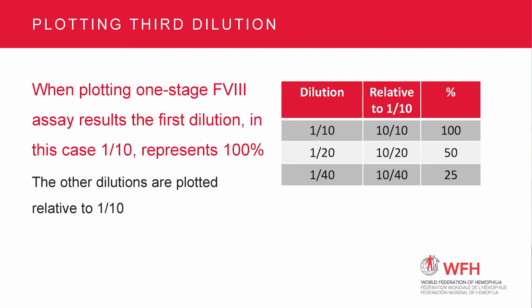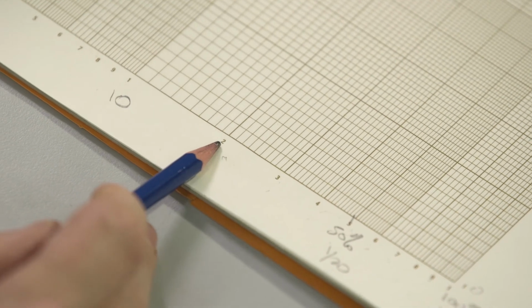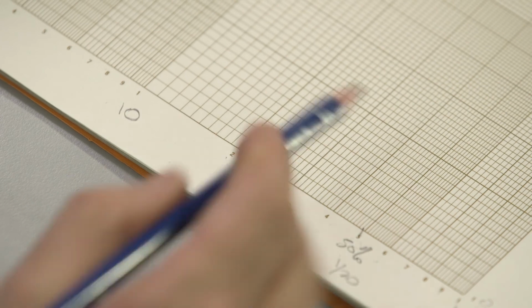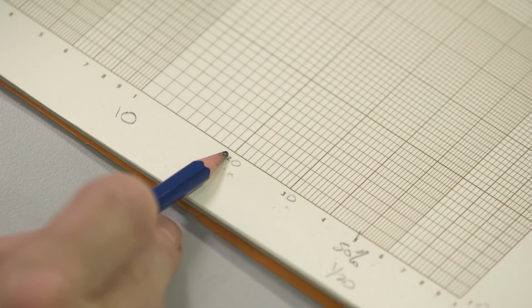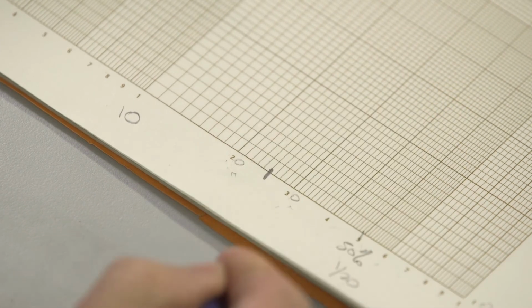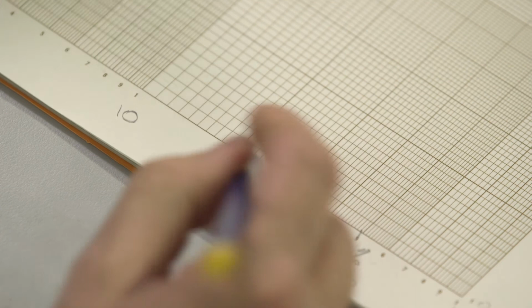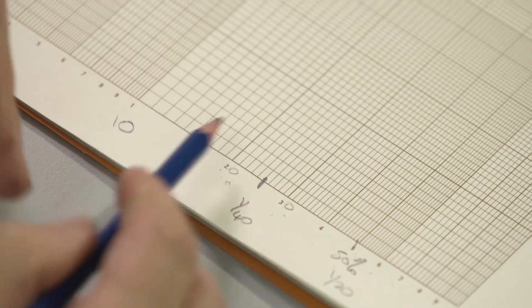10 over 40 times 100, 25%. 50%, 40%, 30%, 20. How many gradations between 20 and 30? There are 10. 20, 21, 22, 23, 24, 25%, 1 in 40 dilution. Clotting times for the standard. These were the two, if you recall, a little different. 85, 78.5. They're a little different.